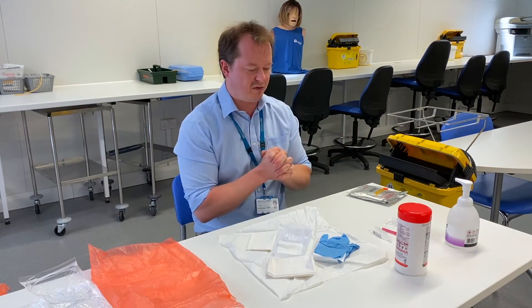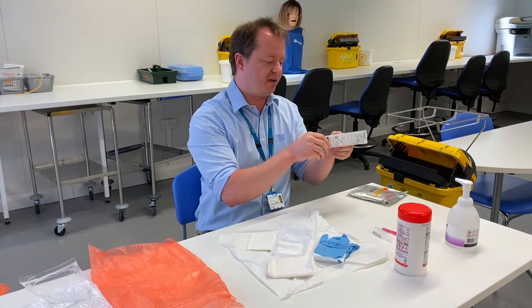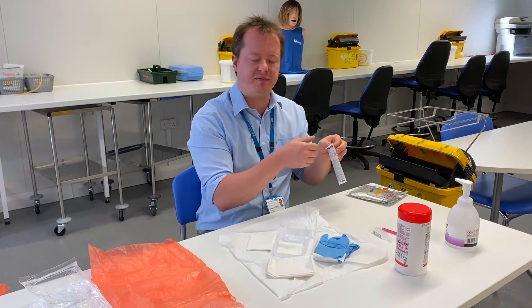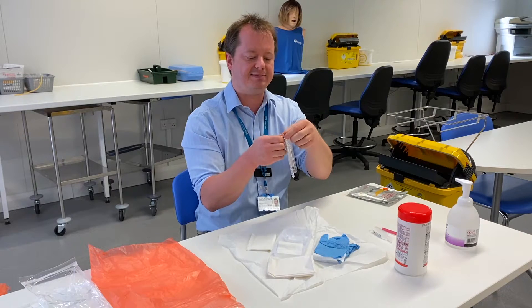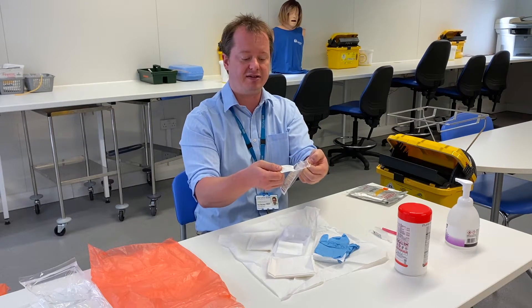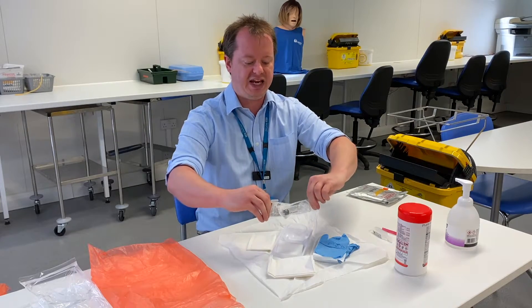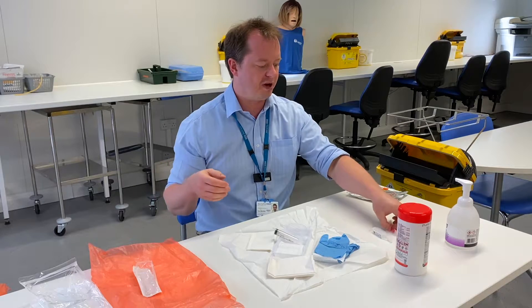Once I've got that all out, I then need to get the products I'm going to be using — either a dressing, or this time I'm going to be using the stuff for a flush. Remember the syringe is completely sterile inside its packet, so I'm going to open this up now. I'm going to open it up without touching any part of it and drop it onto my sterile field, putting the rubbish in my bin.